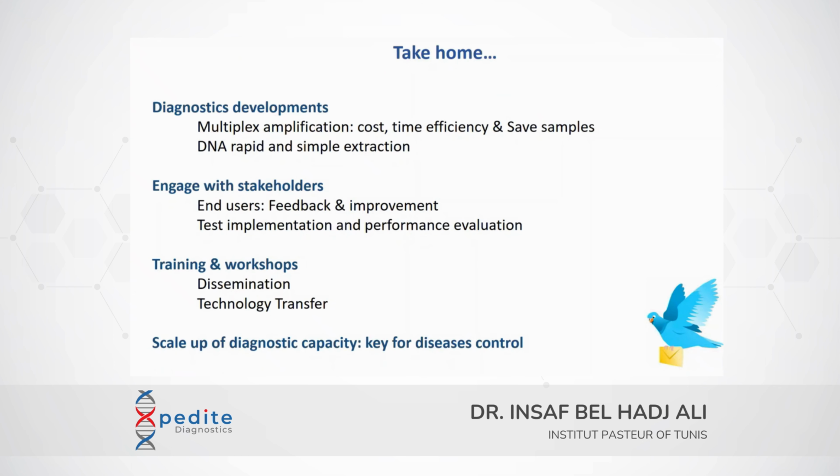So before I finish, I would like to highlight some key messages for molecular diagnostics development. Target multiplexing has proven essential as it may save cost and time. It can also save samples. There is one step that we should not overlook, which is DNA extraction.